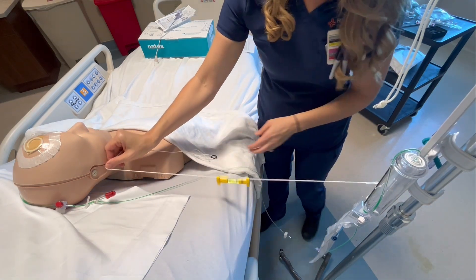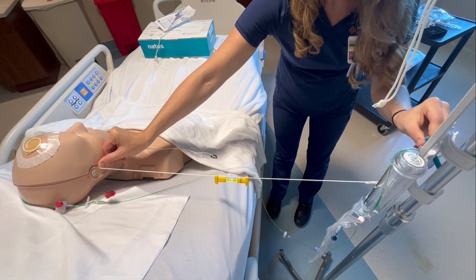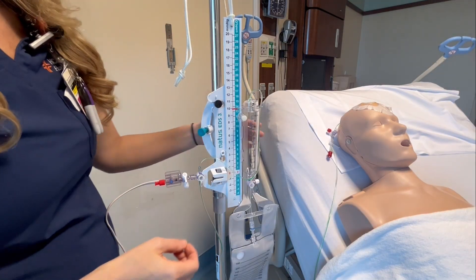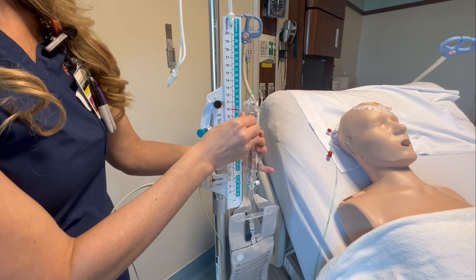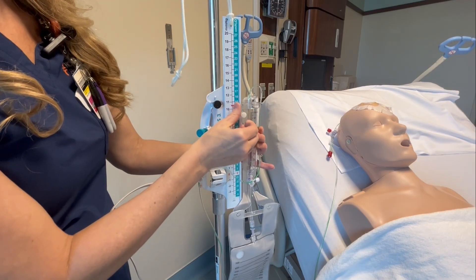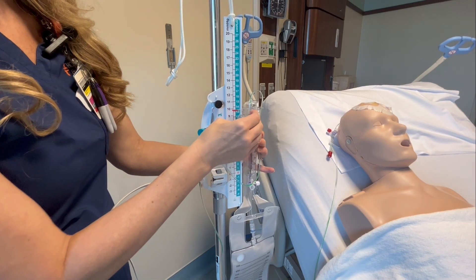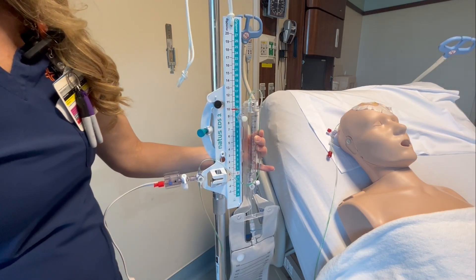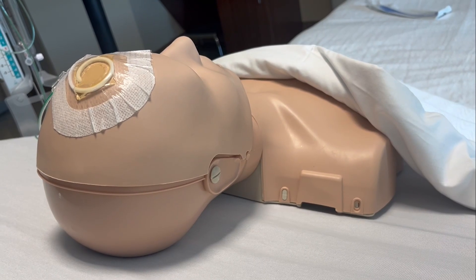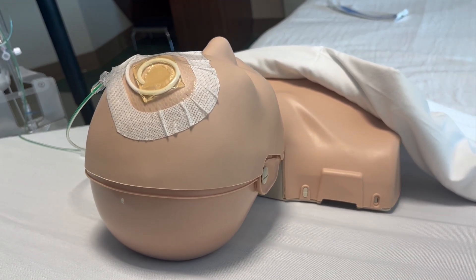In this video, we're going to learn how to take care of the patient with an external ventricular drain, also known as an EVD drain. An external ventricular drain is a temporary drain that both invasively measures intracranial pressure, or ICP, and removes excess cerebrospinal fluid, also known as CSF. It is typically used when the ICP is increased — for example, in the case of hemorrhage, large strokes, tumors, or severe head trauma.